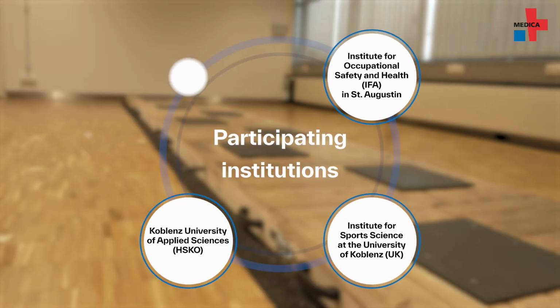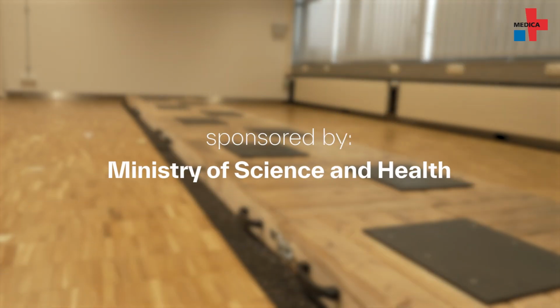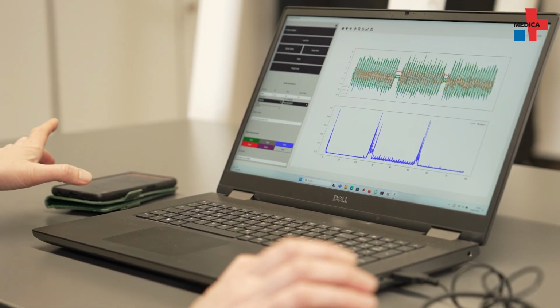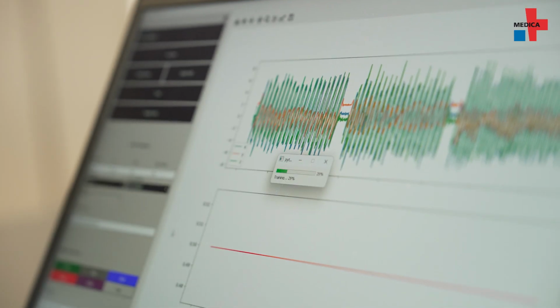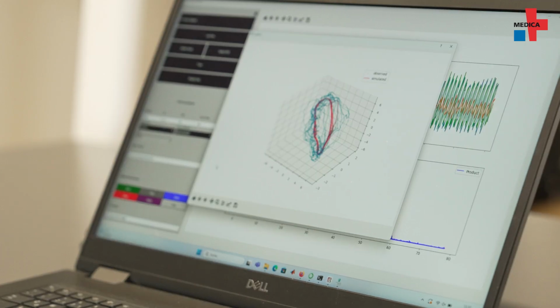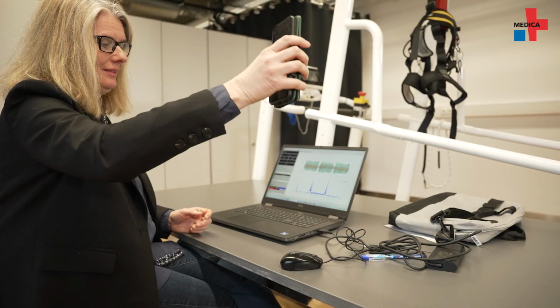The project is working on making gait measurement systems available directly to people in everyday life, whether as wearables or simply via a smartphone. The first steps have already been taken, with a self-developed algorithm that requires very little information. In the AI-based gait analysis subproject, we use acceleration data recorded with a smartphone. We use the data to learn a mathematical model for a person's normal gait. We then identify anomalies as deviations from the normal gait pattern. The aim is to run the process in real time so that we can then transfer it to smartphones and smartwatches.